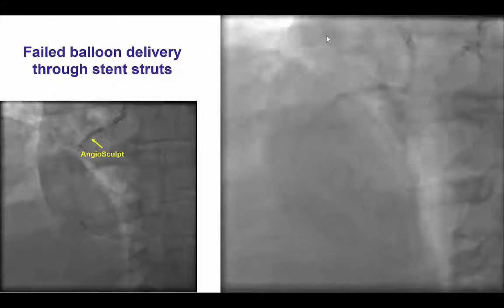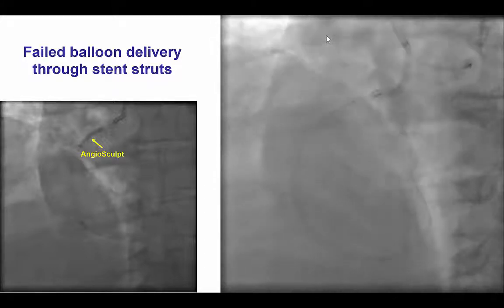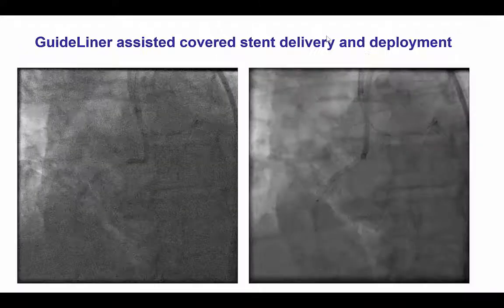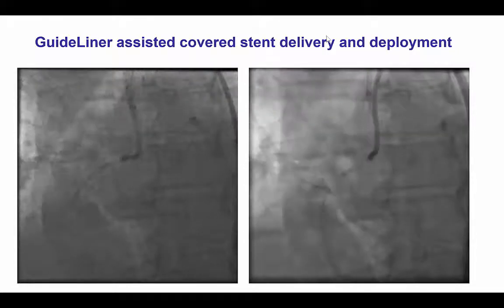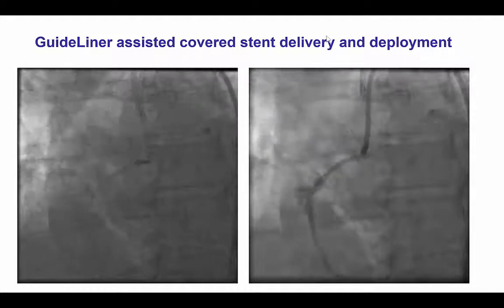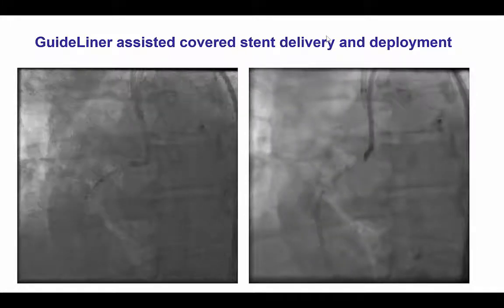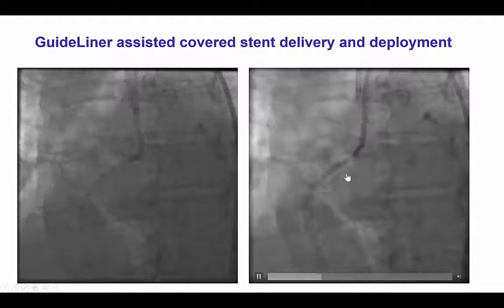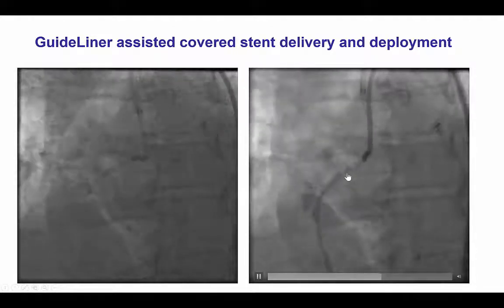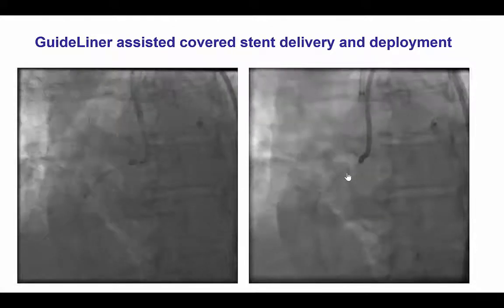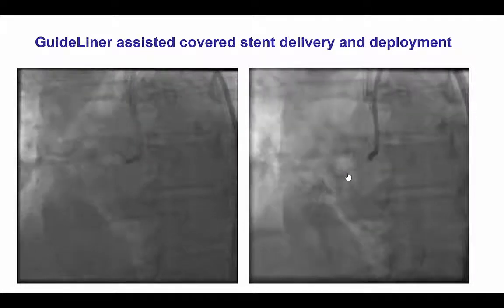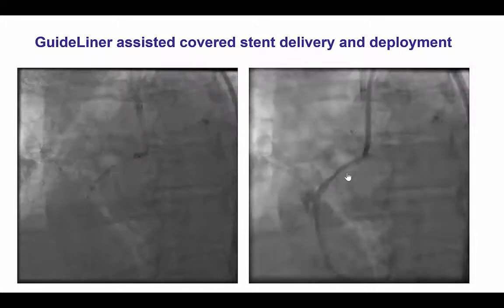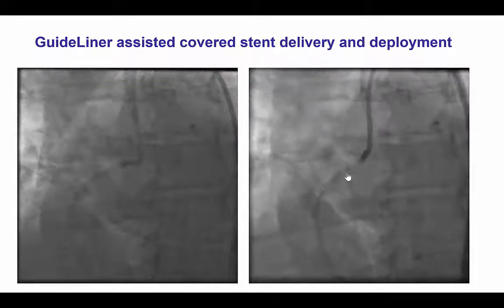We were finally able, with a lot of difficulty, to deliver an angiosculpt balloon, which eventually improved the stenosis, and then we were able to advance a guideliner to the mid-right coronary artery, and deploy a GraftMaster covered stent at the site of the perforation. It is important to know that an 8 French guideliner is needed to deliver the covered stents — they would not fit through a 6 or 7 French guideliner, with the potential exception of a 7 French if they are preloaded before the guideliner enters the guide.